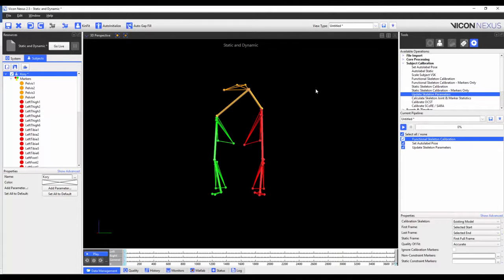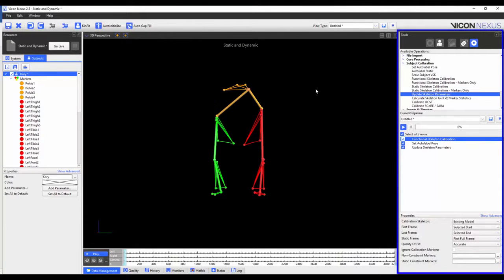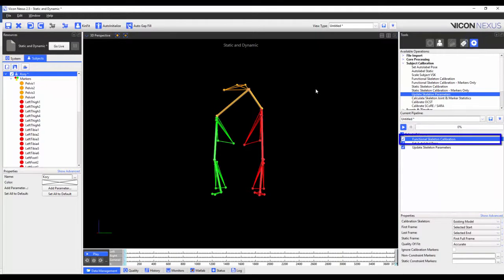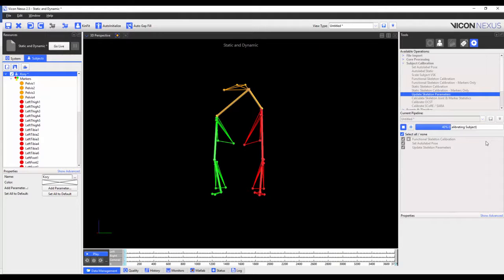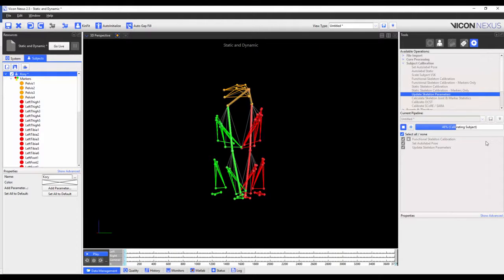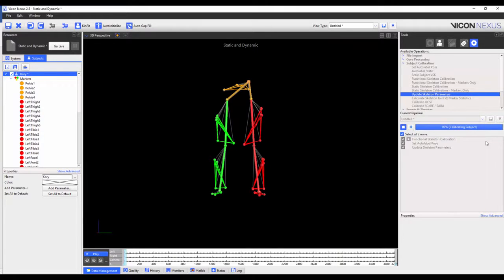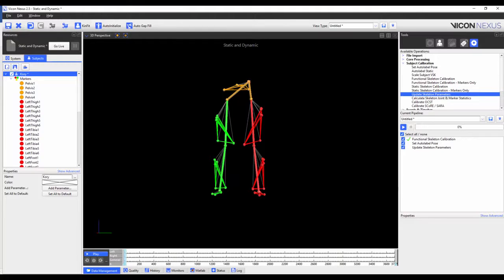Now that I'm happy that my trial is properly labelled, I'm going to go to the Tools pane, Pipelines tab, and run the Functional Skeleton Calibration Pipeline operation. You can see that Nexus has calculated the relevant joint and marker statistics necessary to autolabel this subject. We will be adding this to the template for future subjects, though its performance is optimised if the joints it shows after calibration match closely to the body.